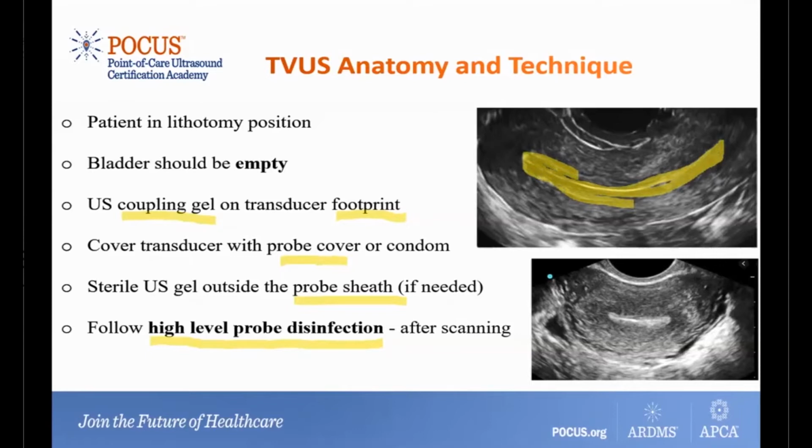In the lower image, we again can appreciate the endometrium pretty well, and it seems like this particular patient has an anteflexed uterus, so the view is almost looking like the transverse view, but the plane of cut is the coronal plane, and because the uterus is pointing anteriorly, we have more like a transverse view over here.